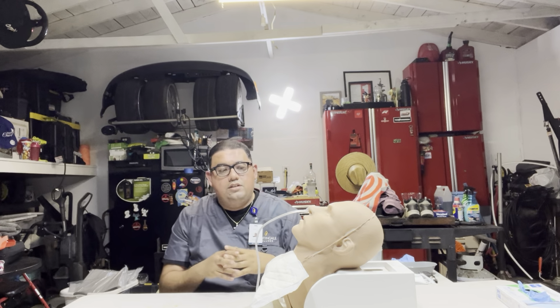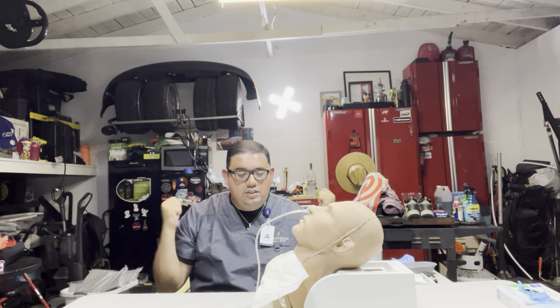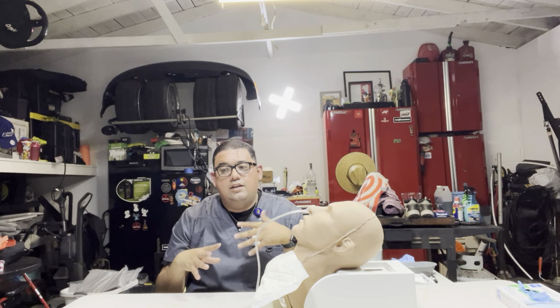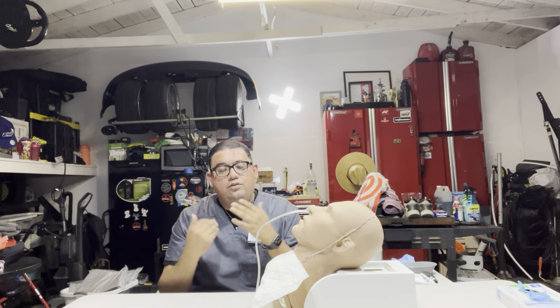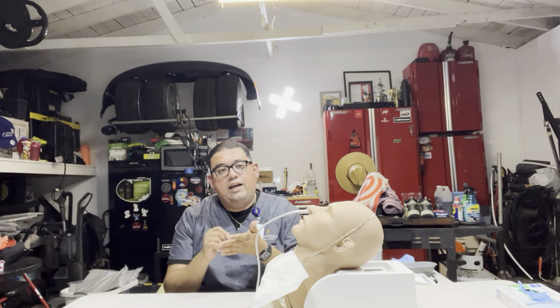And then after you're finished, perform hand hygiene, ensure the patient's in a safe, comfortable position, always raise the side rails, and always lower the bed to its lowest position. After you do that, you want to document the procedure that you did, what measurement you measured the tube at. Ours was at 60, and then the patient's response. Patient tolerated very well.